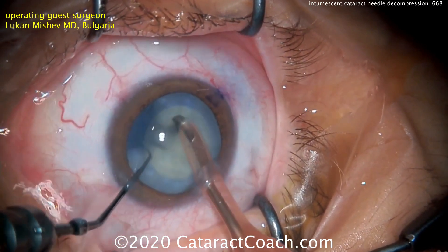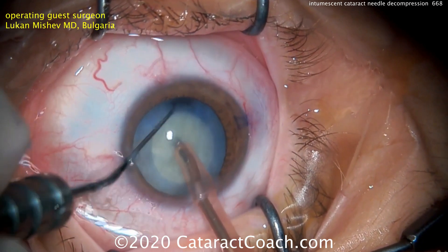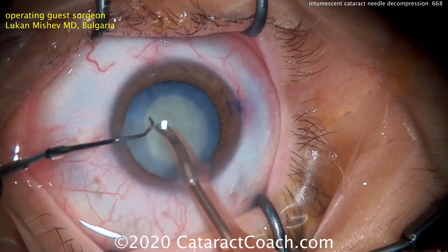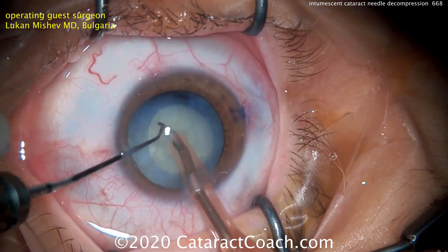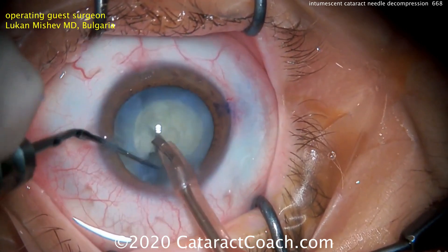He's designed his own chopper and you can see it easily splits the nucleus down the middle, rotates it with the same instrument, and chops again. Multiple chops later, we're going to remove all these pieces. Fun to watch.